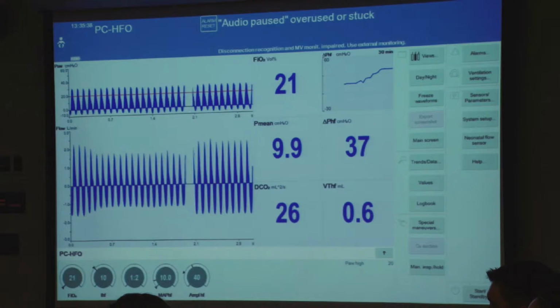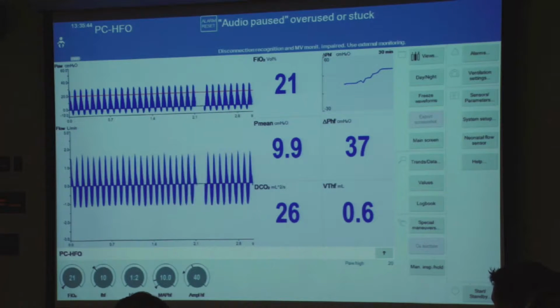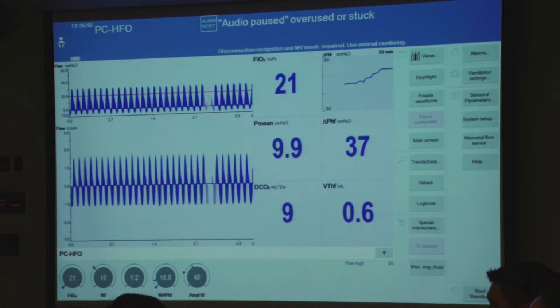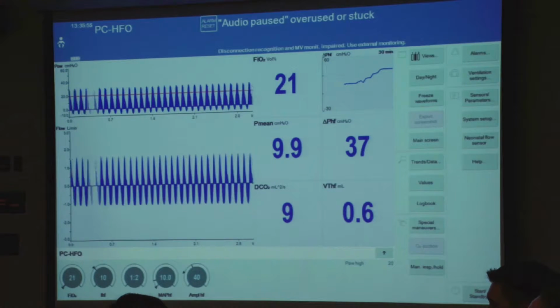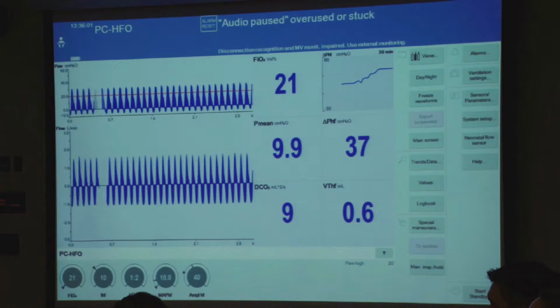For our nursing staff, this is a sign that something's happening, because the system is working perfectly. With a SensorMedics, the sound of the machine, no alarms, everything goes well until the baby starts desatting. But that's a step further. So we can anticipate with this system.